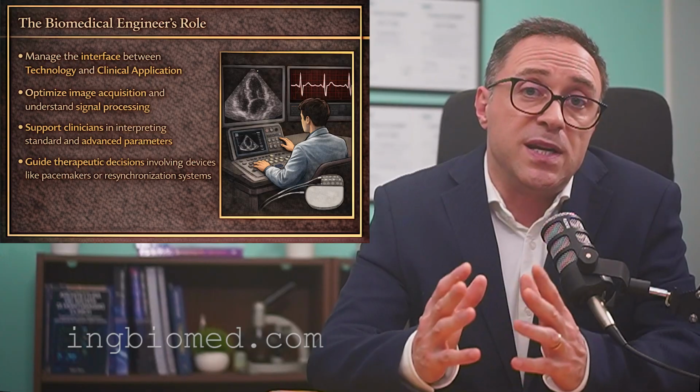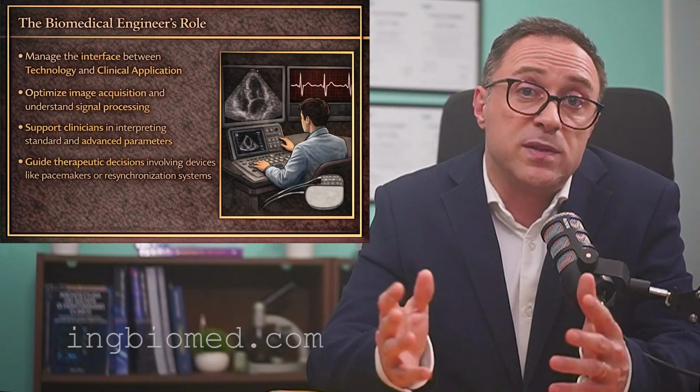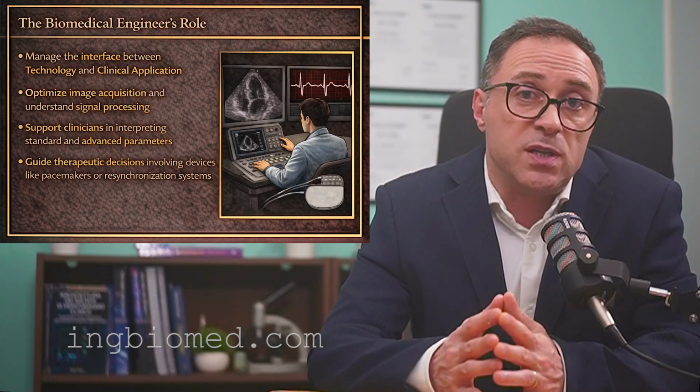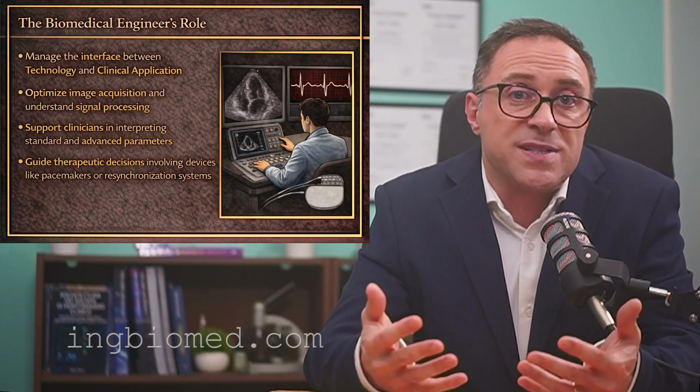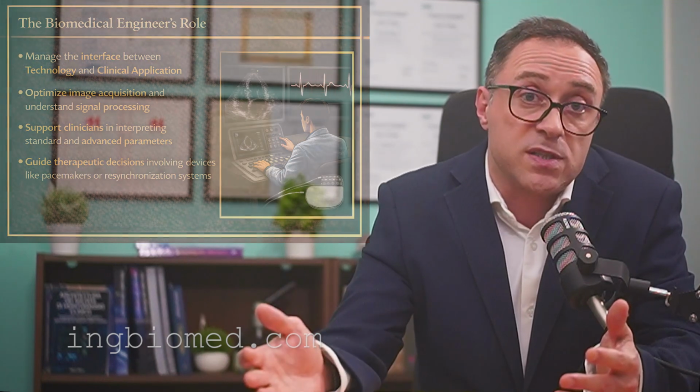At the same time, I am particularly interested in how imaging findings can guide therapeutic decisions, especially when dealing with devices such as pacemakers or resynchronization systems.